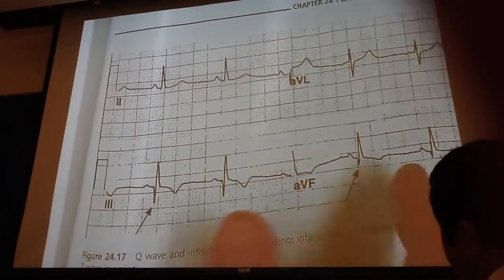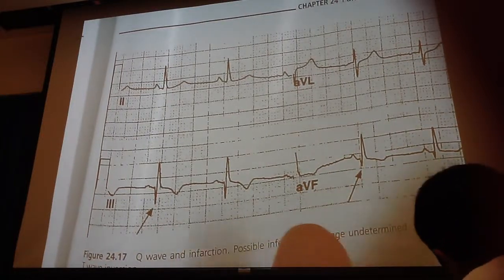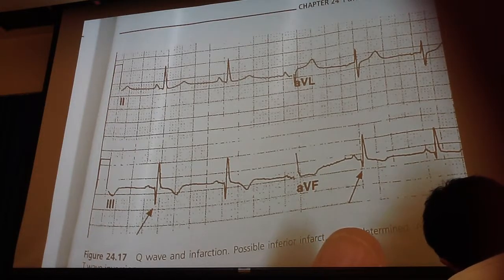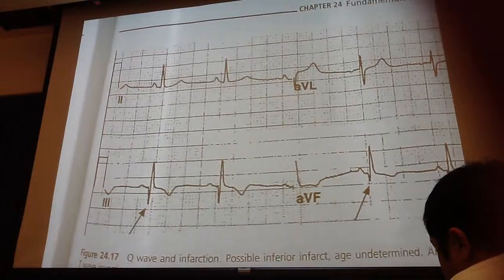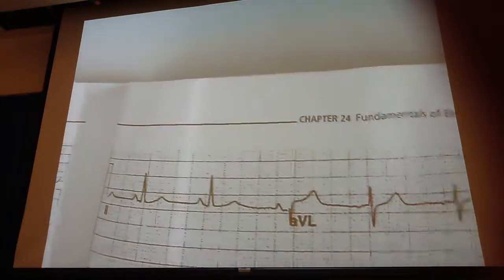Well, what I'm trying to get through here on the EKG is that you need to be familiar with the different patterns. So you need to look at PR intervals, inverted T waves, Q signs and things like that, elevated ST segments. I tried to list most of them in the handout that I gave you, and like I said, in the textbook, I've got some good ones there.